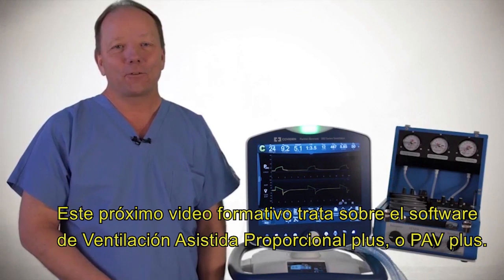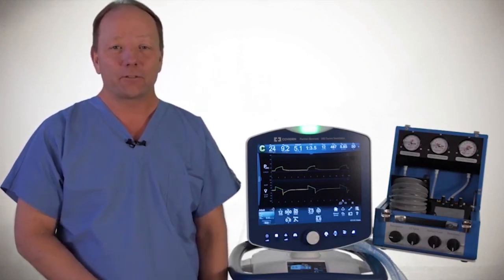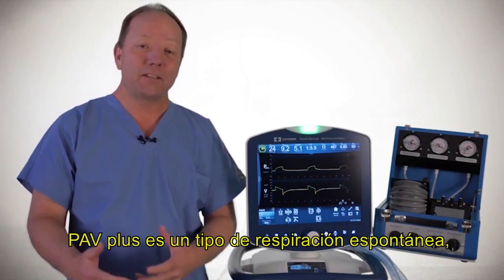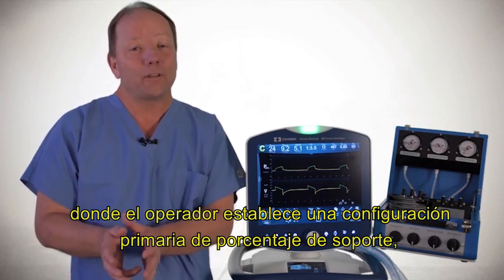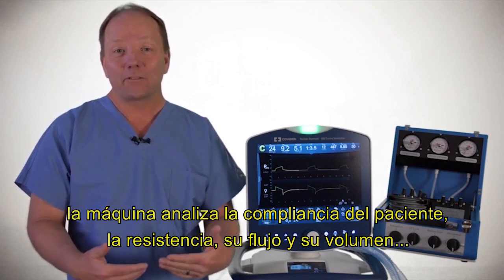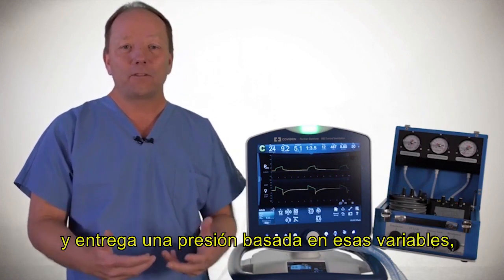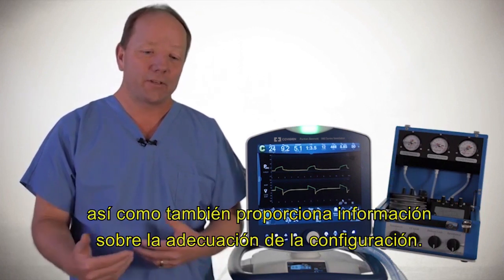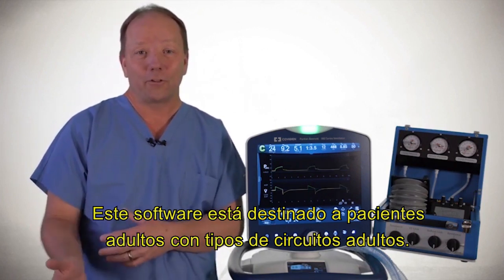This next training video is around the Proportional Assist Ventilation Plus software, or as we commonly say, PAV Plus. What is PAV Plus? PAV Plus is a spontaneous breath type where basically the operator sets one primary setting of percent support. The machine actually analyzes the patient's compliance, their resistance, their flow, and their volume, and delivers a pressure based upon those variables, as well as giving feedback on the adequacy of the settings.